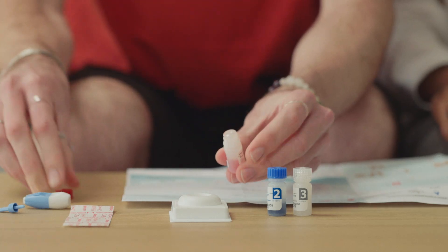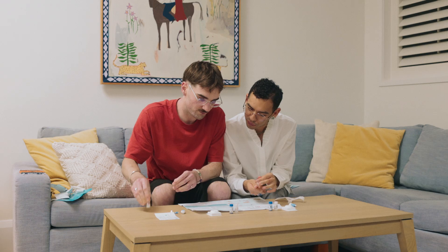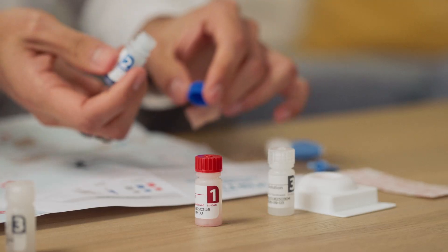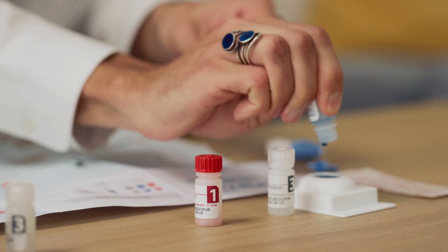Step 6. Pour bottle number 1 into the test device well and let it soak through. Step 7. Now pour the blue bottle number 2 into the test device well and let it soak through.